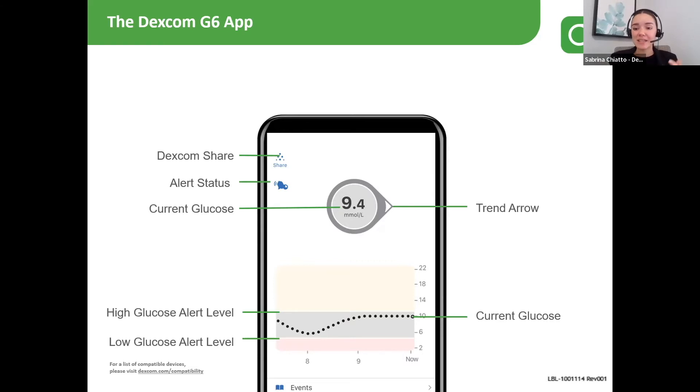However, if they saw one arrow down, this would mean they're decreasing, versus two arrows down, meaning they're decreasing really rapidly.